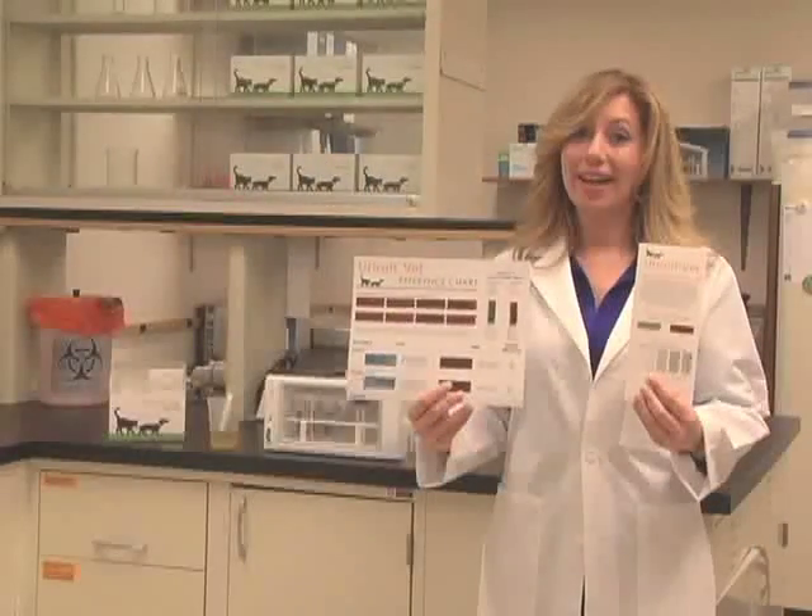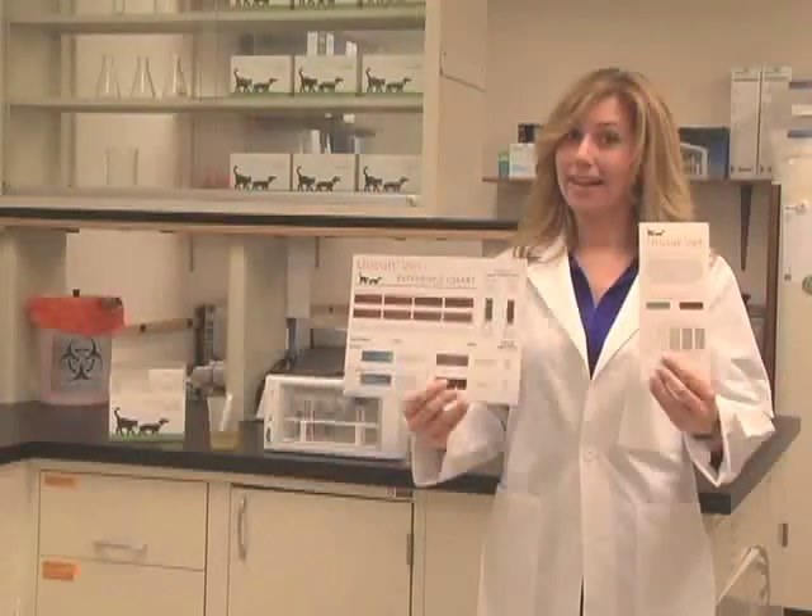Next, you'll need one Uricult VET dip paddle for each test that is performed. And finally, the Uricult VET slide guide or wall chart will help you make an estimated colony count or preliminary identification when you're ready to read the results.